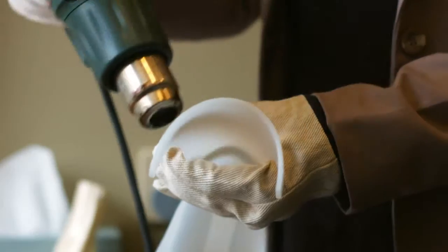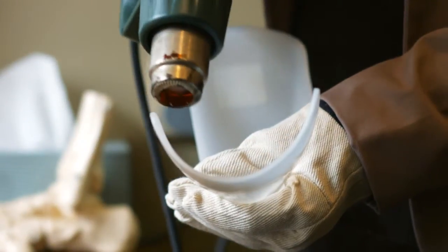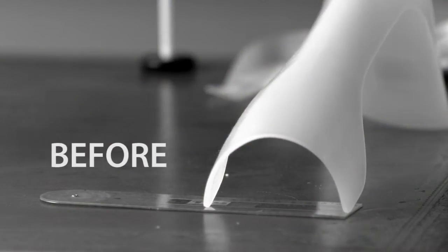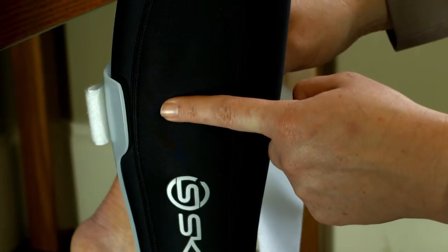Apply general heat to the calf section. The same principles apply to all areas.